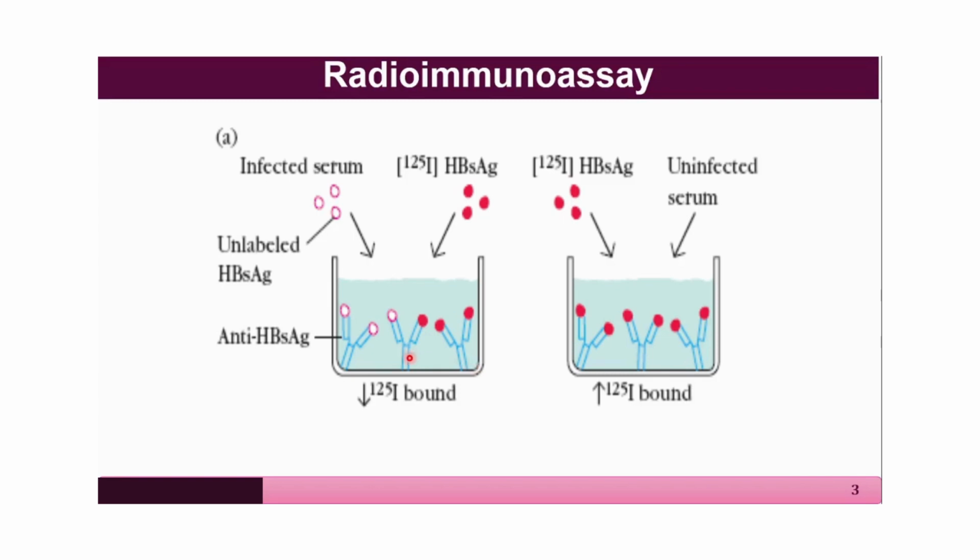The immobilized antibodies will be readily available in the container, to which the serum sample of the infected person is added, together with radioactively labeled hepatitis B antigen.